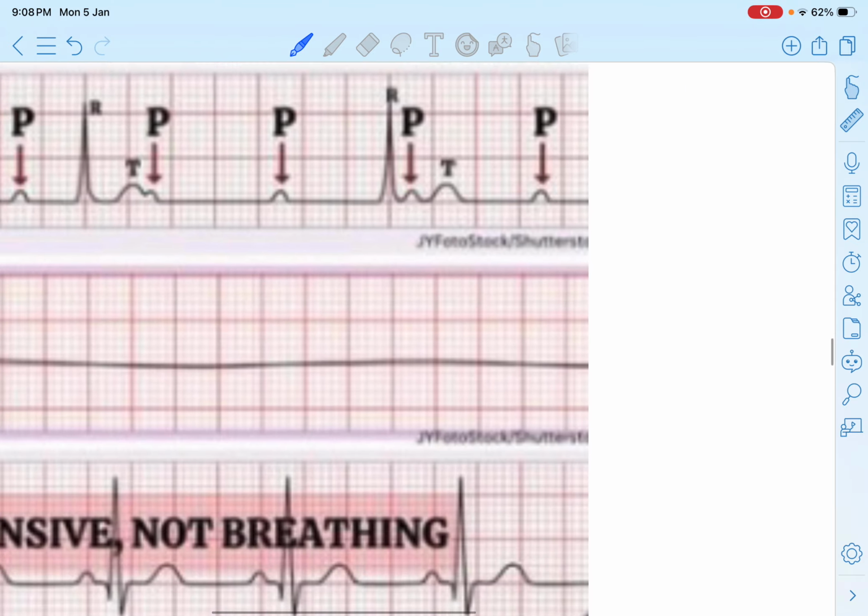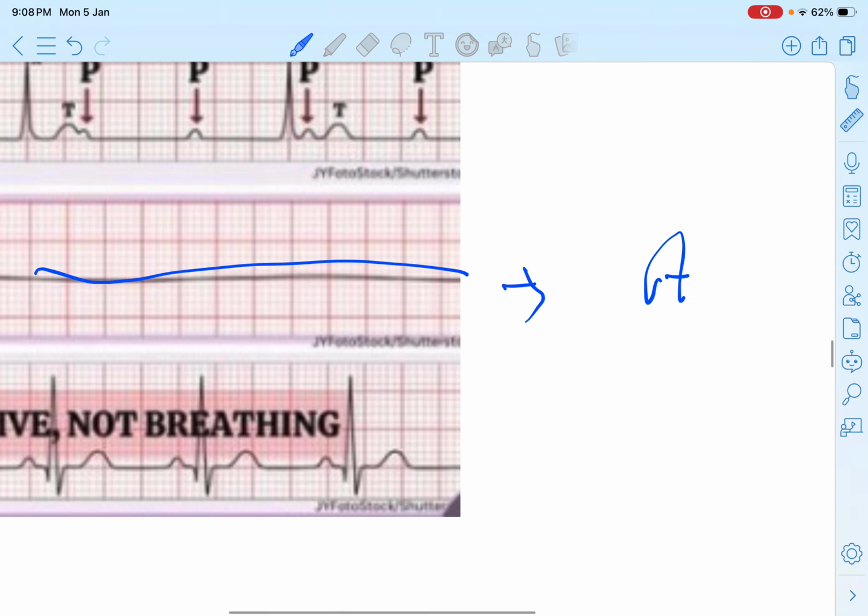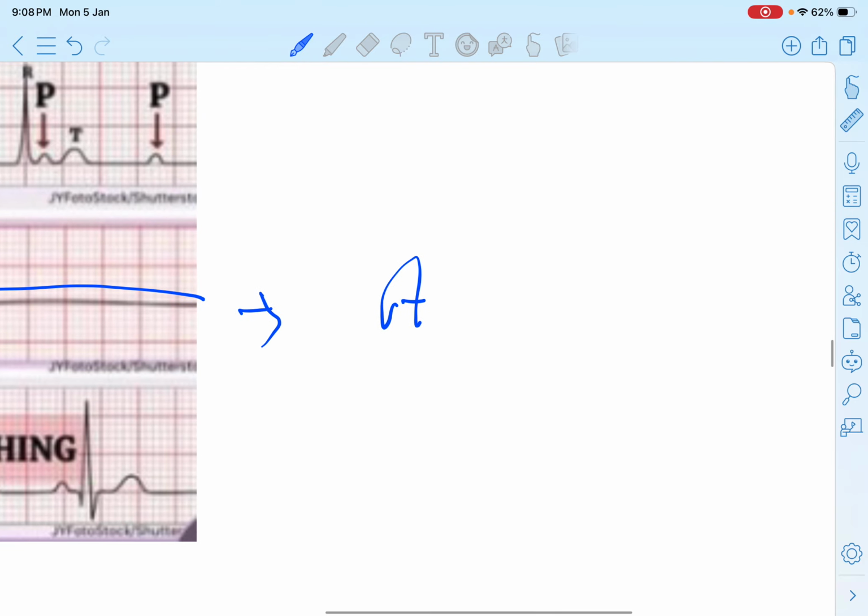Okay, this is a plain graph. That is called asystole. There is a standstill, start CPR. If you notice a plain graph on your five-para monitor and ECG, you will start CPR, following the ALS protocol. What is ALS? Advanced life support.